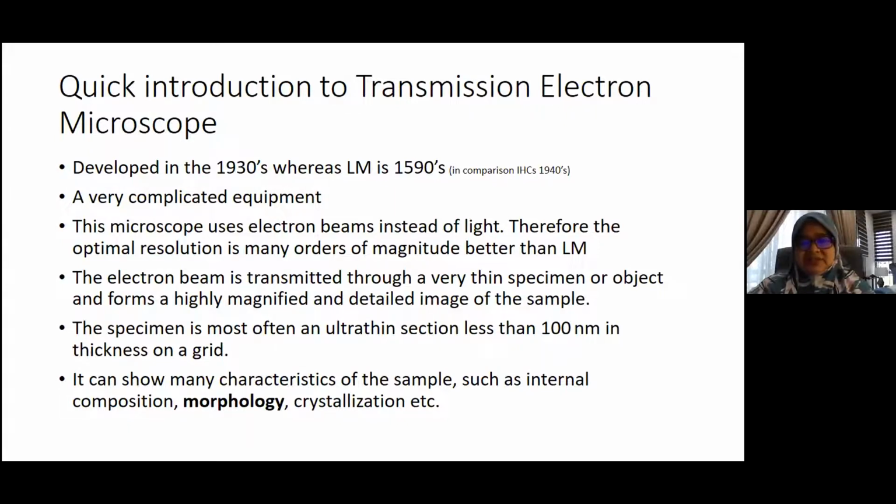So the transmission electron microscopy will allow us to see various characteristics of the sample, such as its internal composition, its morphology, which is our main usage in renal pathology, and crystallization, etc.